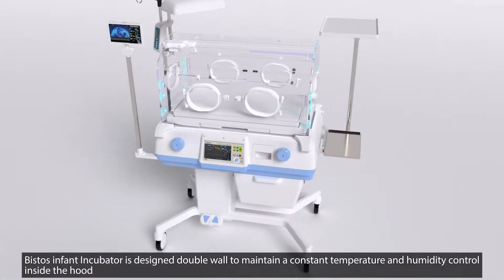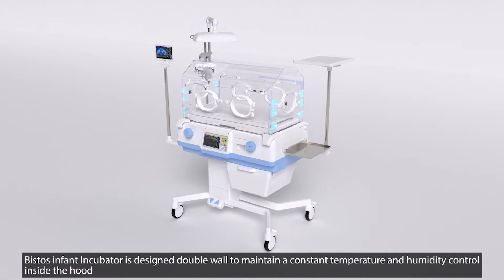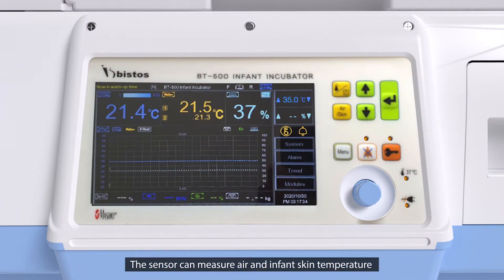The Vistos Infant Incubator is designed with a double wall to maintain a constant temperature and humidity control inside the hood. The sensor can measure both air and infant skin temperature.